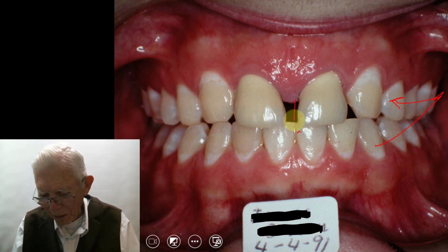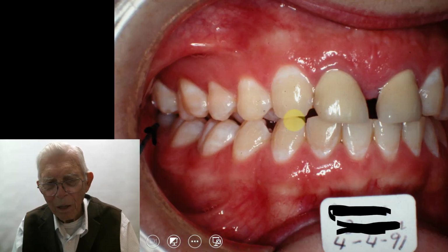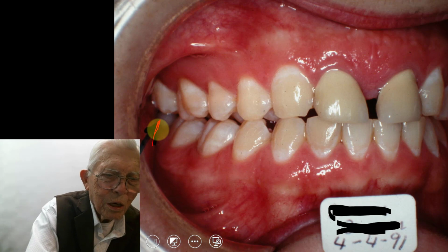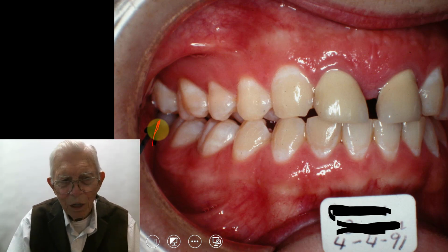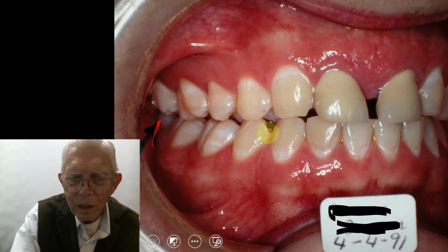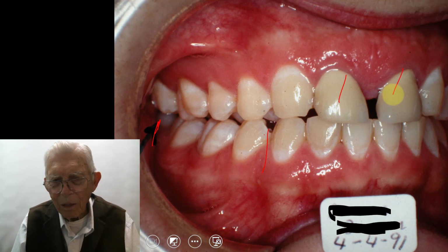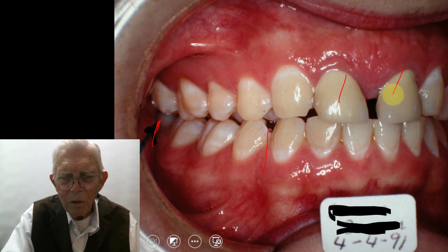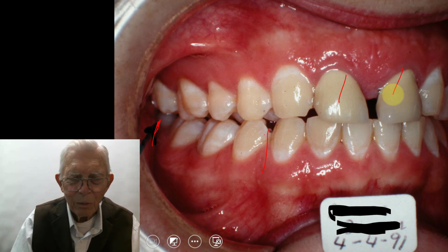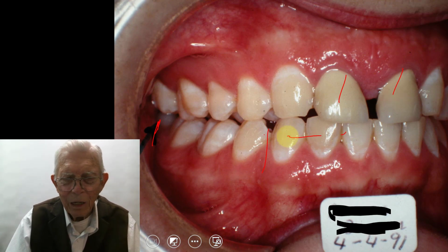I hope you get something out of this, and let's see, this is fitting pretty good. And this side over here, all right. Well, here is the wisdom tooth, you see. So we did get his wisdom teeth to come in, we've taken a first bicuspid over this side and the centrals over on here and moving the teeth up. The gap that we needed, we didn't get enough space from reducing the bicuspids, trading them for centrals up here, or we'd have had room to move these back in and stay there.